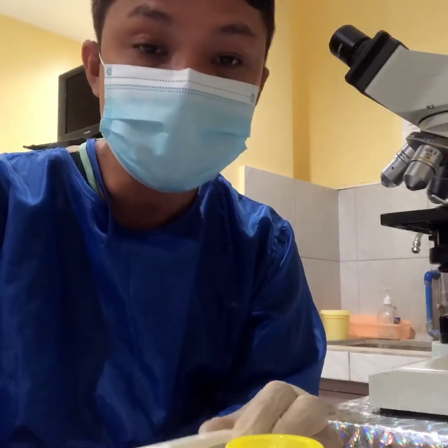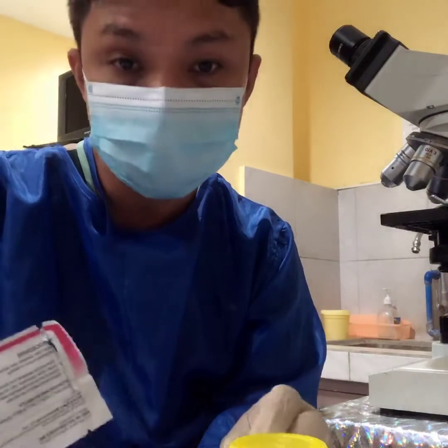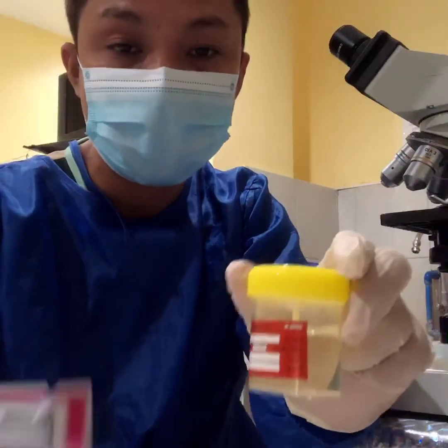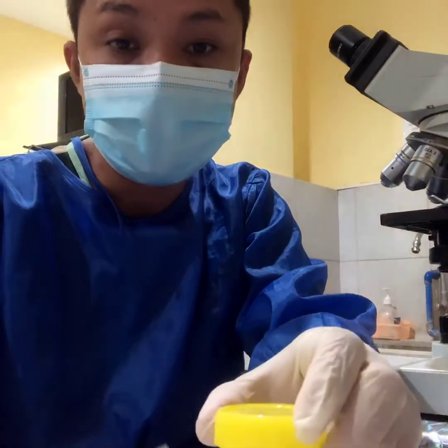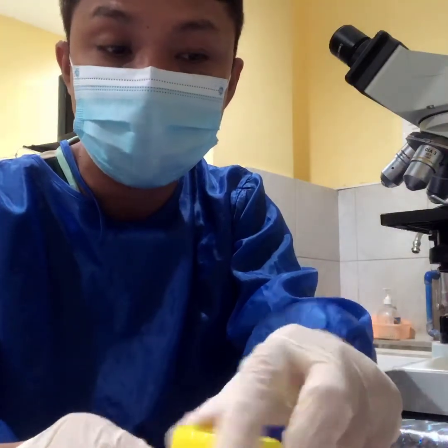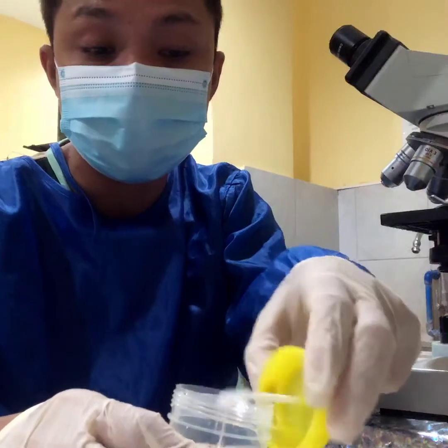At the same time, this is only a qualitative test, so we just have positive or negative. It would not determine the concentration of human chorionic gonadotropin. Ideally, the sample for our pregnancy tests would be the first morning urine. You can also use random urine, but you need to be careful with that, as it might result in a false negative result.